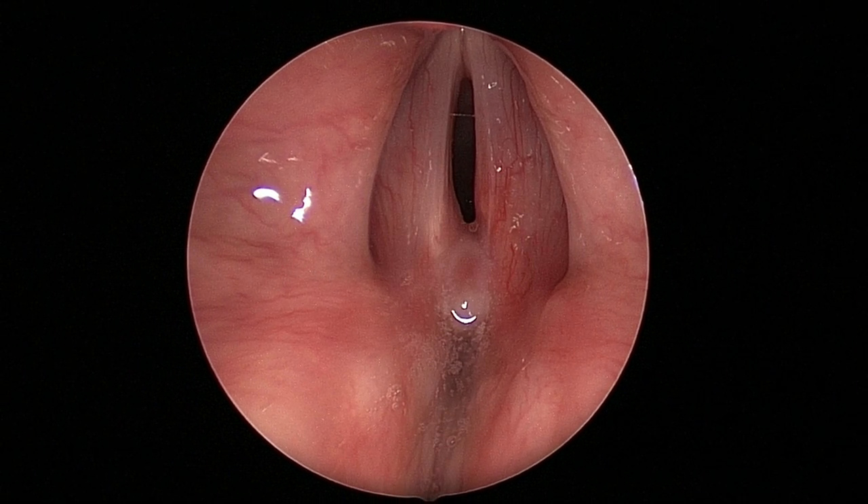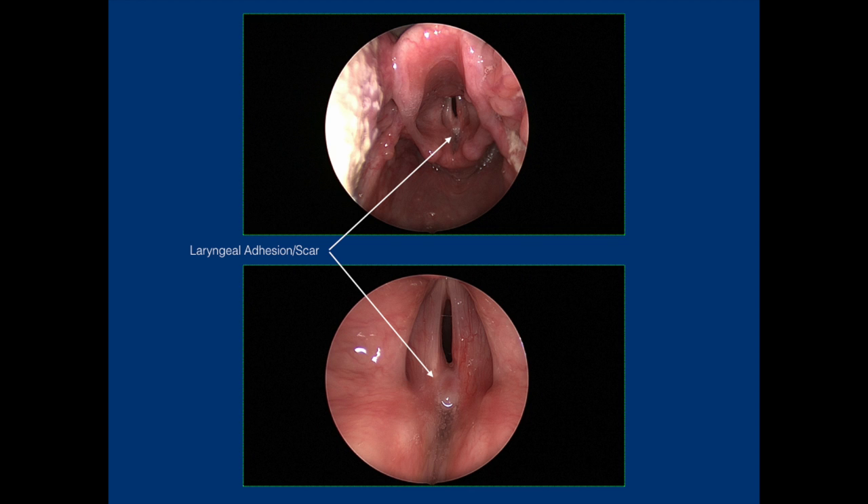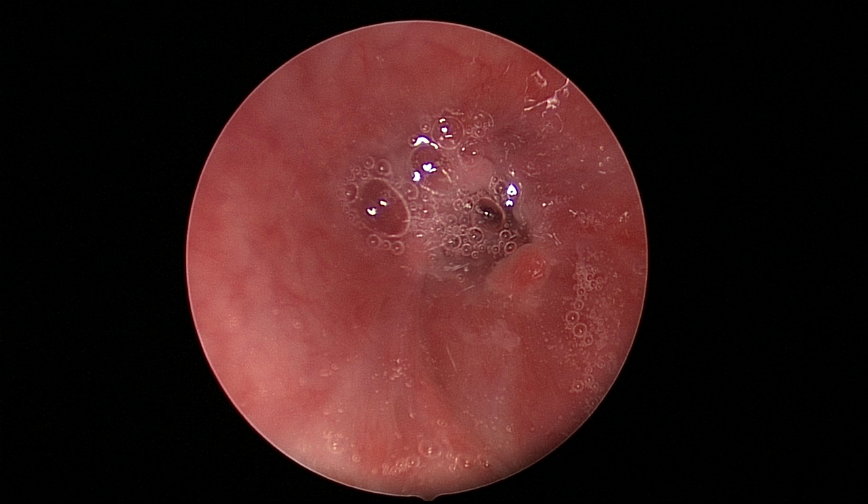You can see the laryngeal stenosis fused together, sort of an adhesive scar, if you will. And then this is the tracheal stenosis, about a grade 3.